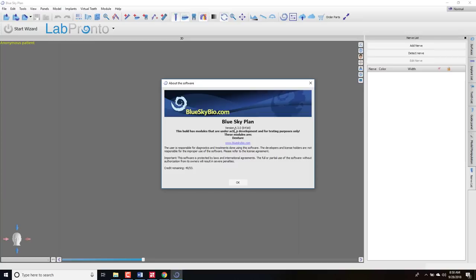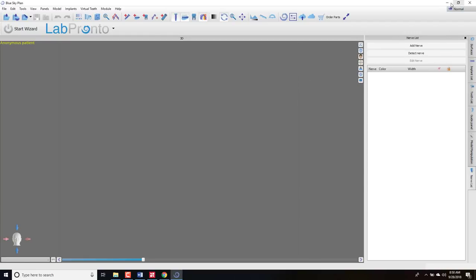This is version 4.3.0 and I'm doing this on 9-28 of 2018. With the nature of the internet, if you're watching this six months from now, most of this will be irrelevant, so you might just look for a more updated video of the beta software. What we're going to do is simply open up Blue Sky Plan.